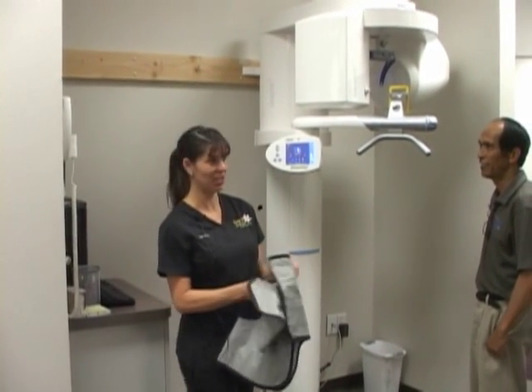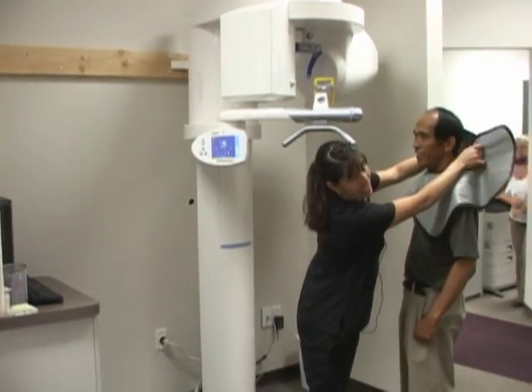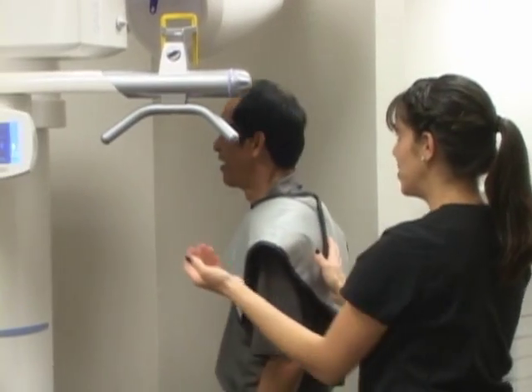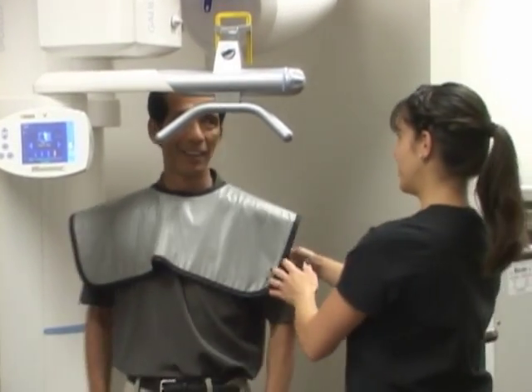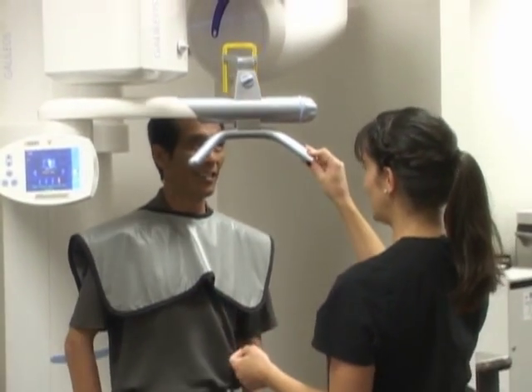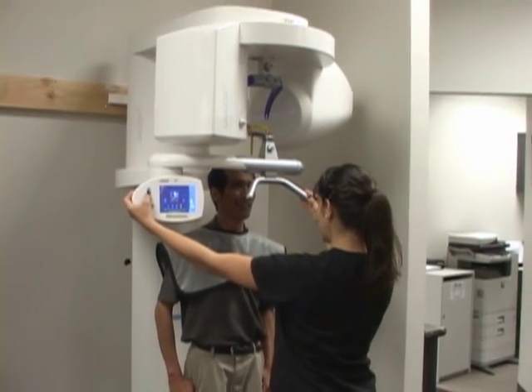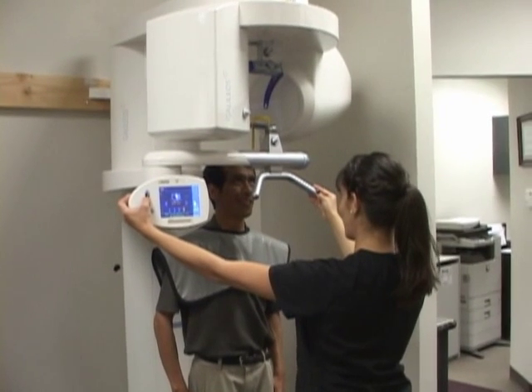For patient protection, we cover our patients with lead aprons. If you can walk in towards the machine, towards the back of the machine, and then turn around and face me. Scoot back just a little bit. I'm going to move this. I'm going to lower the machine to your height. Just watch your head.